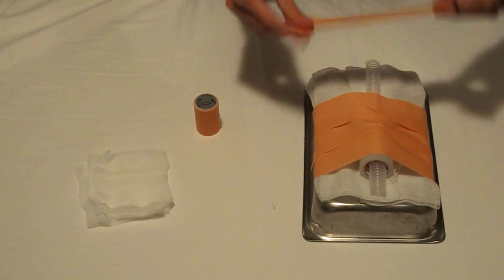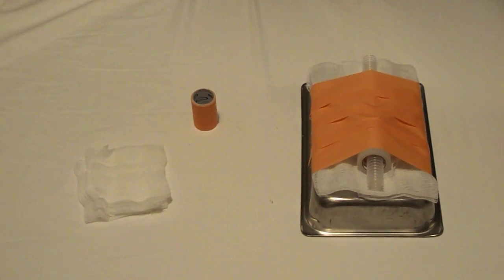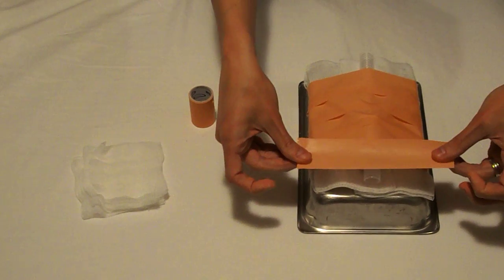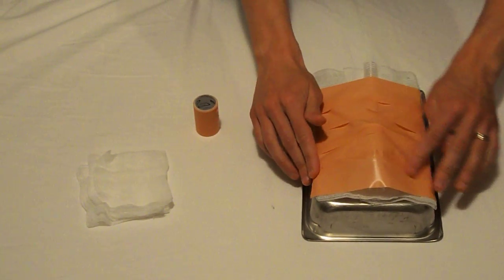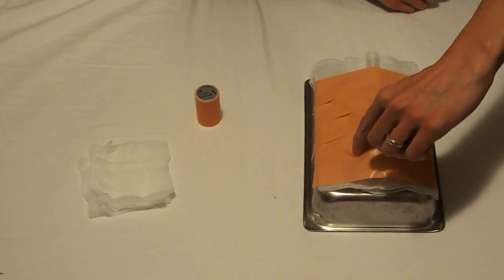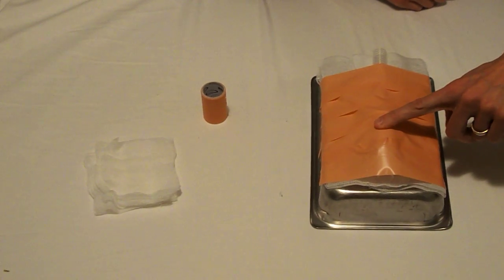It's not necessary to completely cover up the entire trainer as you can imagine but you just want to cover up the cricoid and thyroid cartilages and then now you can feel your thyroid cartilage here and your cricoid cartilage and feel your cricothyroid membrane.